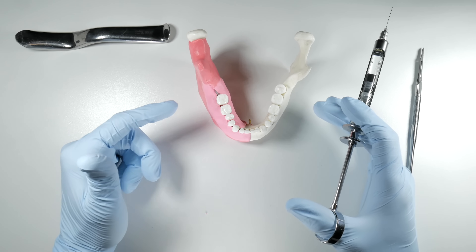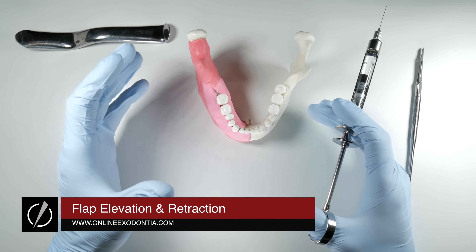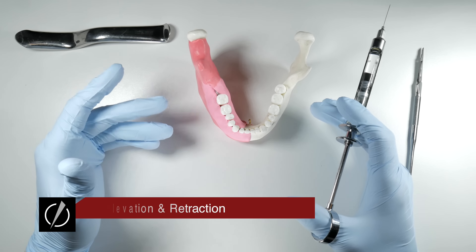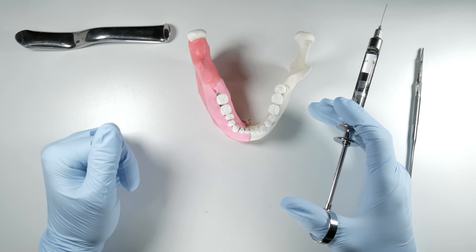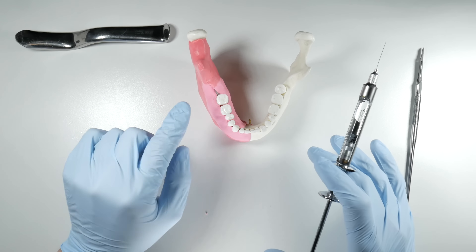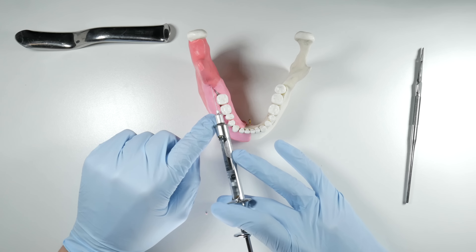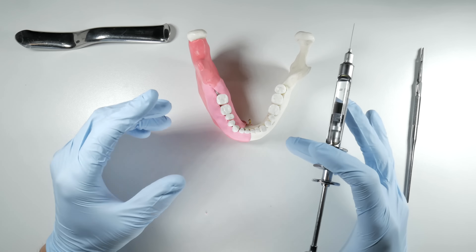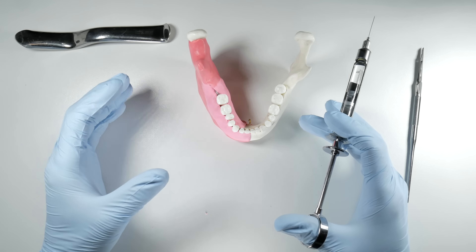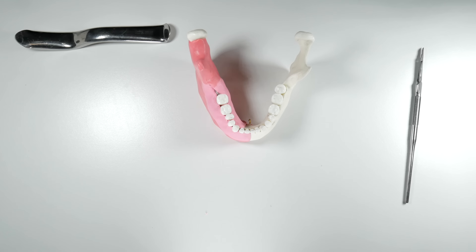Another challenging thing about lower third molar impactions is that you have to reflect the flap that you designed, and that can be a bit of a challenge when you're getting going. The envelope flap is sometimes a little bit more work to reflect or get open than a triangular flap, but it is typically my flap of choice. Prior to making your incision, you'll be doing your buccal block — I would suggest putting a fair bit of solution in there, at least 0.6ml and probably close to 0.8 or 0.9ml, which helps get some fluid under the tissues to assist with the reflection of your flap.